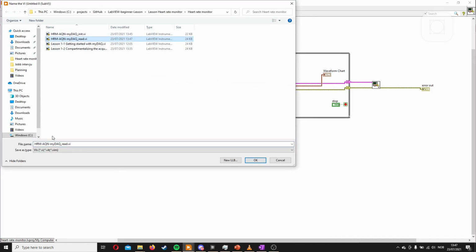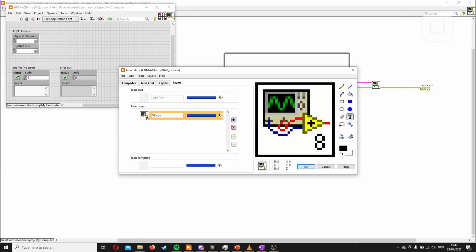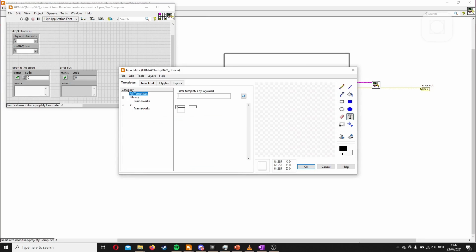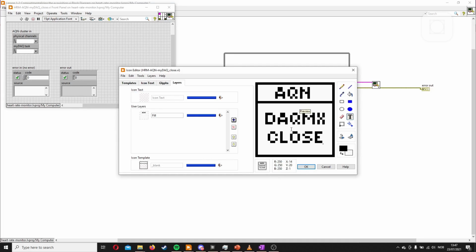We'll just save this as the close. And then edit the icon just the same as the other ones. White background, boom, boom. Text, go back to black. Acquisition. Then DAQmx. Close. And move it a little bit more center with the arrows.